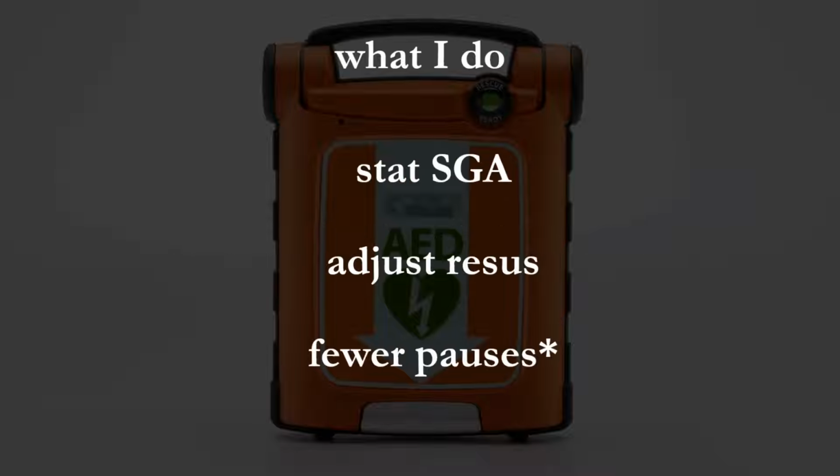So how do I actually use this in practice? There's always a tendency by critical care professionals, rapid response responders to get an ET tube in the patient as fast as possible. I don't really do that, and that's kind of beyond the scope of this discussion. There's reasons why we should consider maybe waiting on that. So generally what I'll do is I'll have someone place a supraglottic airway just to be able to connect the mainstream end tidal, so that you can monitor the adequacy of CPR and monitor return of spontaneous circulation. This is obviously an opportunity to be able to adjust your resuscitation in terms of CPR adequacy or CPR rate, and in the end, really probably should lead to fewer pauses in CPR.